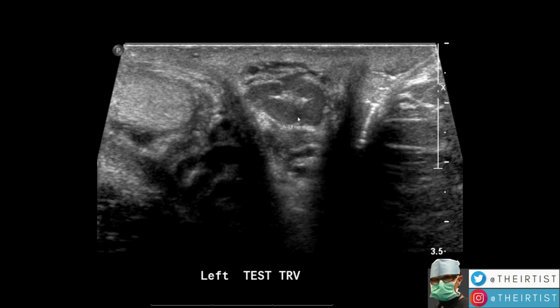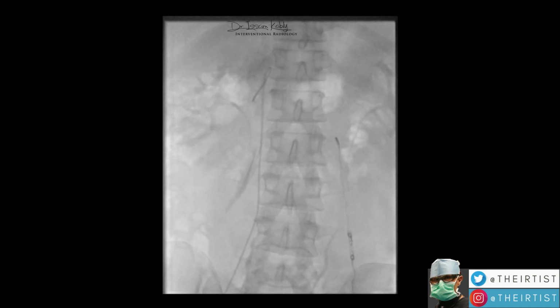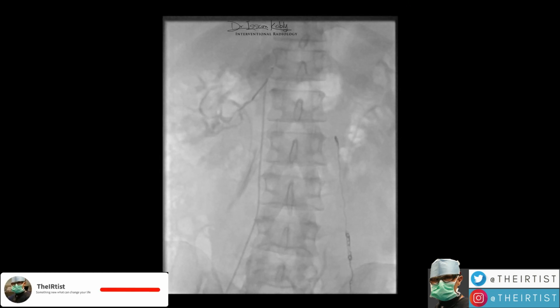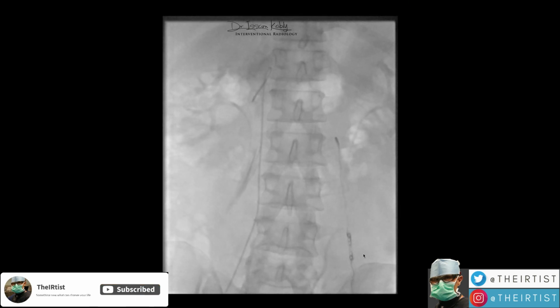Inside you can see the hyperechoic stagnating blood. So this young patient has bilateral varicocele. He had, prior to that, undergone surgery with the microscope that failed to help him, since his varicocele came back again and recurred. So he was treated by interventional radiology, by coiling and placement of sclerosing agent.